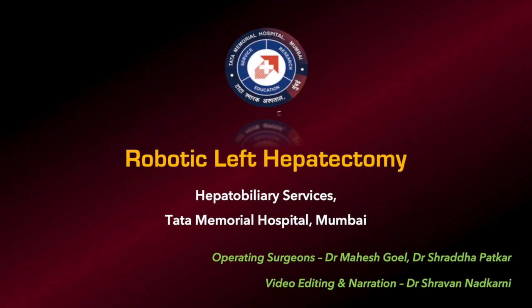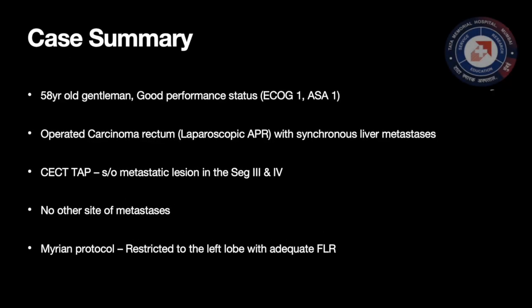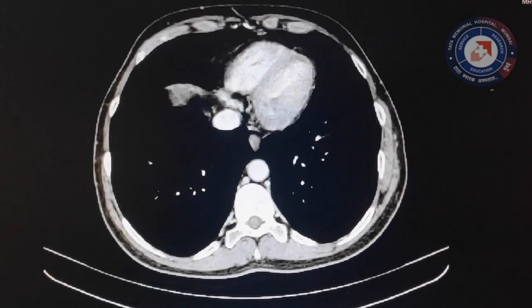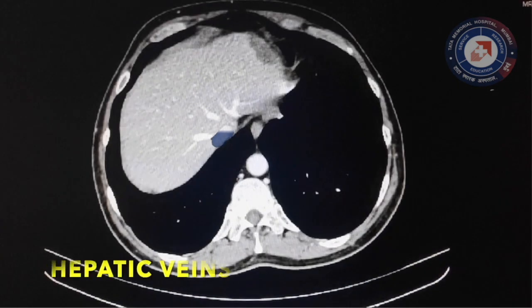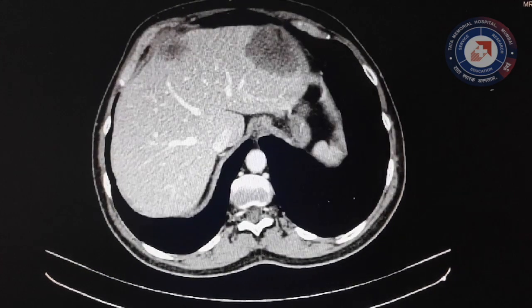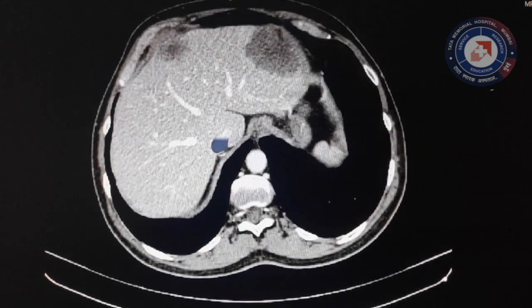Presented here is a video of left hepatectomy performed with the Da Vinci XI robotic surgical system. Our patient is a 58-year-old gentleman with good performance status, noted to have synchronous hepatic metastasis from a rectal adenocarcinoma, status post abdominal perineal resection. Imaging confirmed metastatic deposits in segments 3 and 4 of the left liver with adequate functional remnant for a planned left hepatectomy.